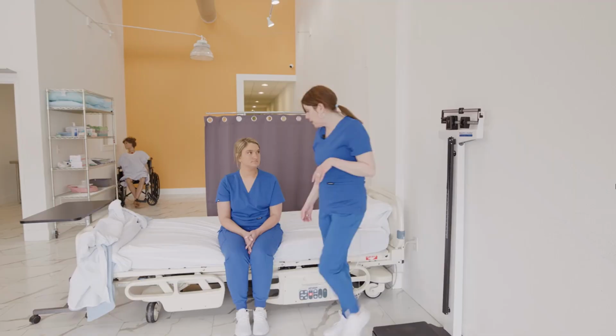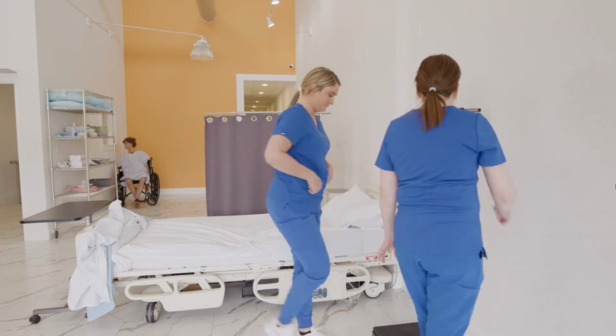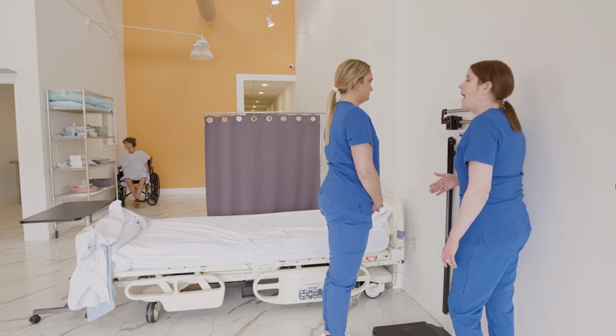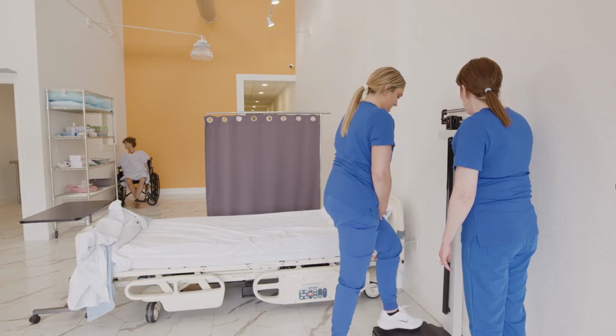So Miss Megan, I'm going to get you to go ahead and stand up. I'm going to have you stand right in front of the scale. I'm going to make sure my scale is on 0, and then I'm going to have my patient stand in the center of the scale. Go ahead and stand in the center of the scale for me.